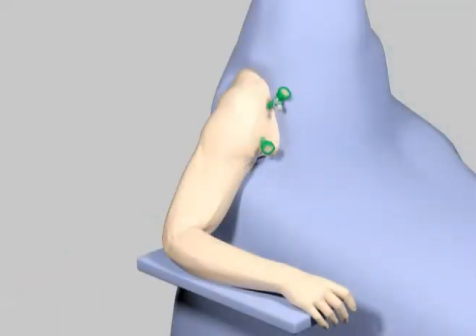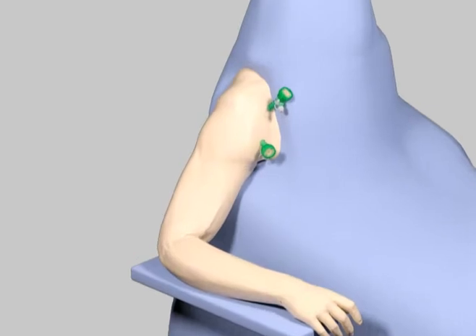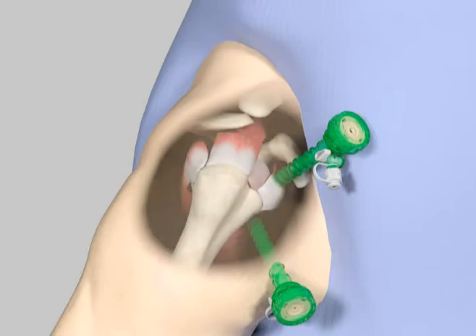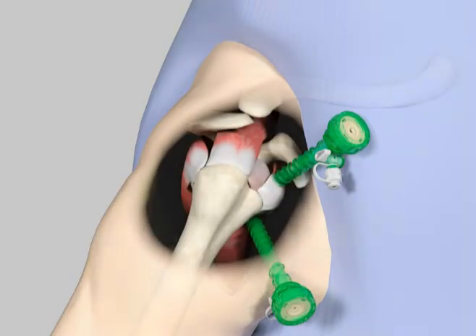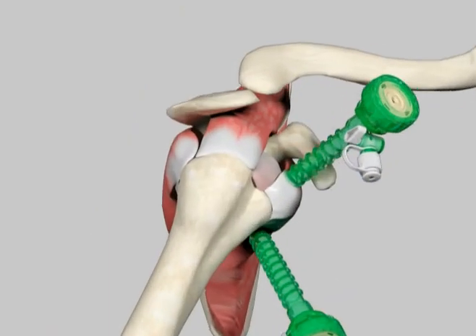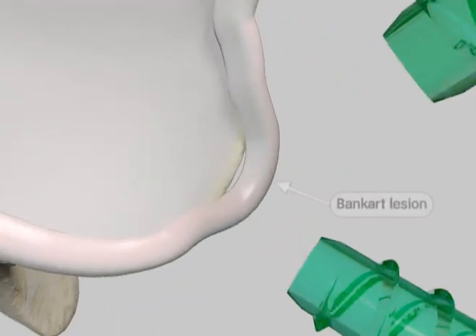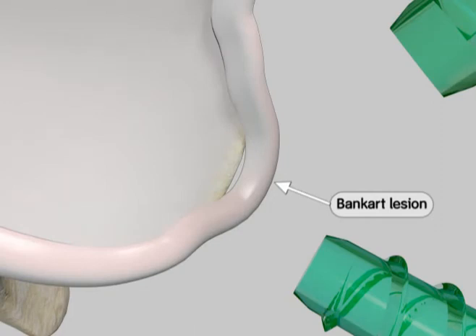Now we will review the technique in detail in a patient. 2 standard anterior portals are used, showing clear track cannulas. The procedure can be done using one portal if desired. The internal view shows a typical Bankart lesion located at the 5 o'clock position.